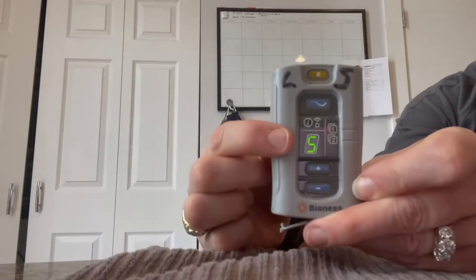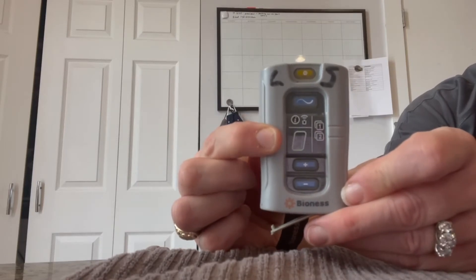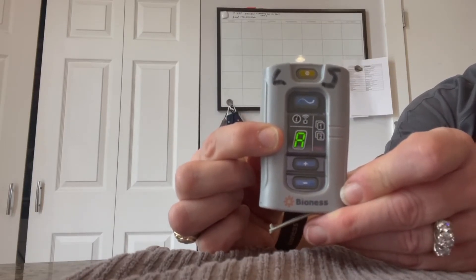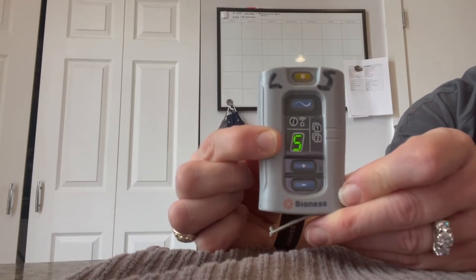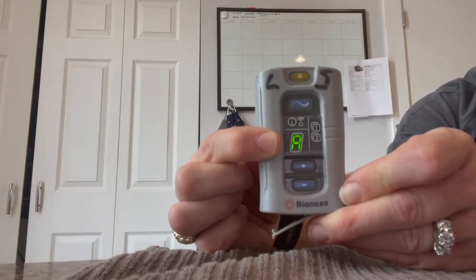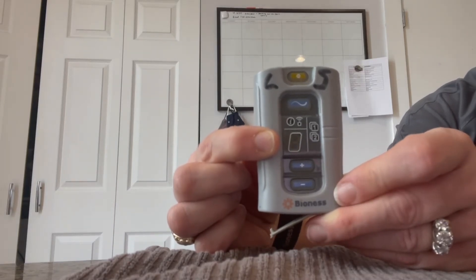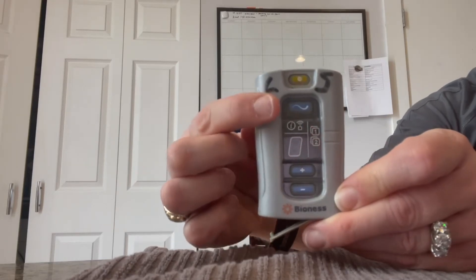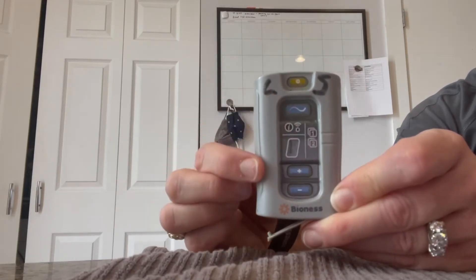In the control unit display, you will see alternating number 5 and the letter A. Each of the seven programs is indicated with a letter. For instance, letter A is functional training, grasp, and release. If I wanted to run this program with my patient, I would hit the wave button to start the stimulation.